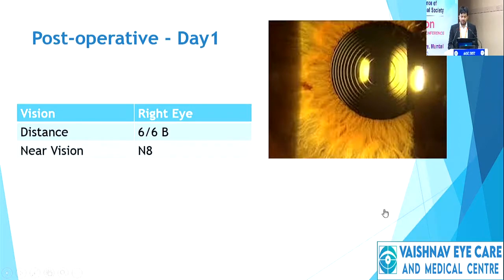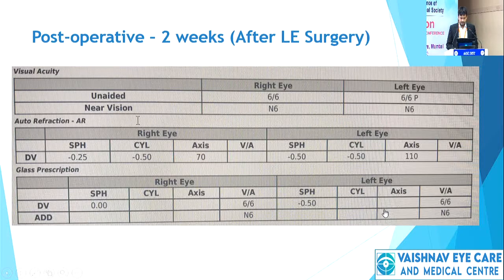So post-op day 1, this was the day where I could hardly sleep, the night before, I mean. The patient was happy, so was I. Patient had a decent vision, 6x6 blur with a good near vision. The lens was centered. I did dilate to confirm it.